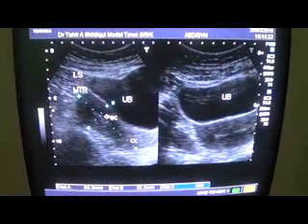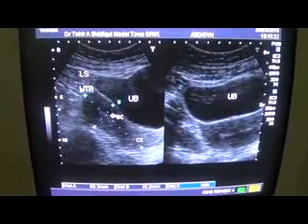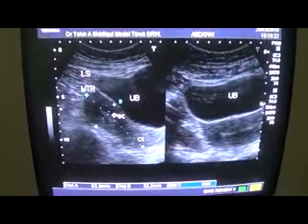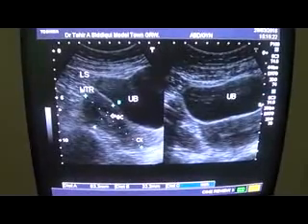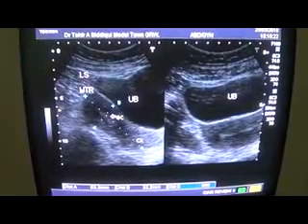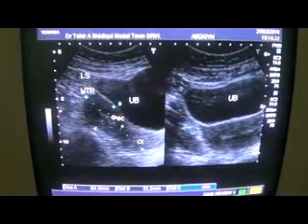This further image is that of a 26 years old female, married 9 months and residing in UK. Ultrasound has been performed there, showing different pathology, a different picture as compared to what I am seeing over here. Now, I have frozen this image to show you the longitudinal section, first the dimensions of the uterus.